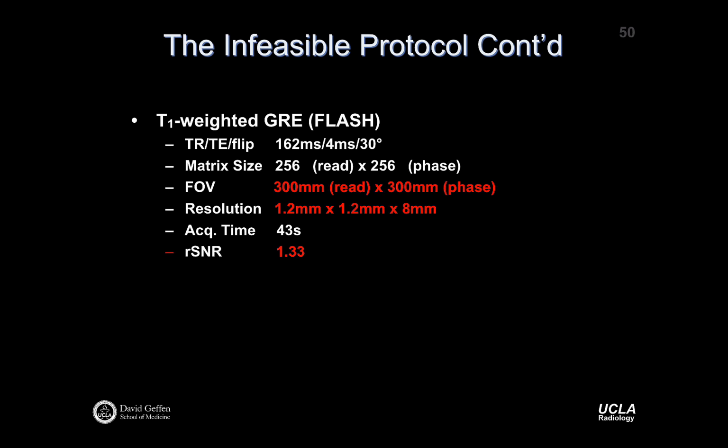All right. So what's highlighted here is the things that changed. I'm not going to change everything every time. And in fact, in the lab on Wednesday, don't change a bunch of things, right? Be good scientists: change a parameter, see what happens. Change a parameter, see what happens. And the other rule of thumb on Wednesday is the scanner should always be running, right? You should just keep cranking out another test, another example. If you sit there and talk about it for 10 minutes before making a change, you won't win. It's a little competition between you and the other group on that scanner. So keep scanning.